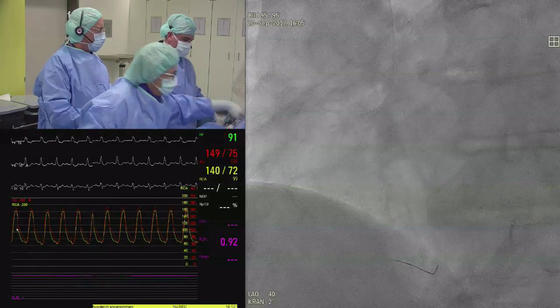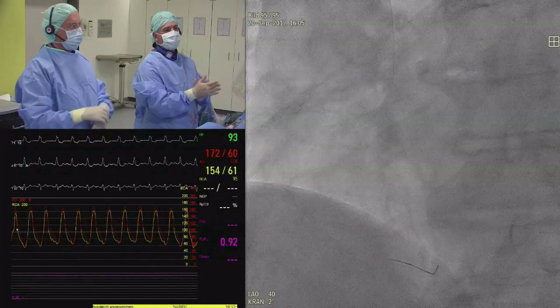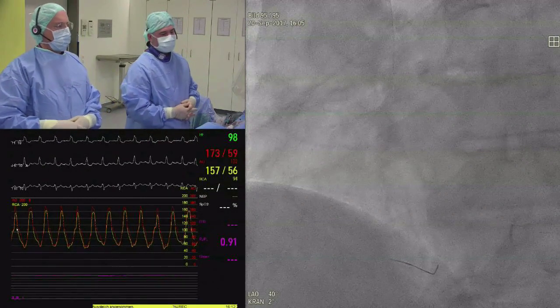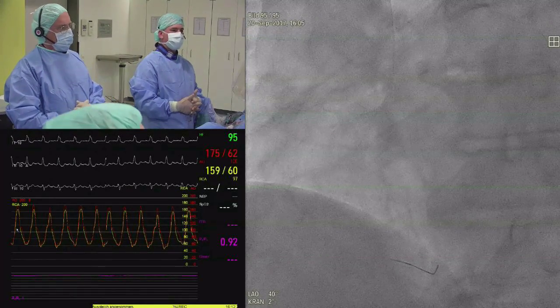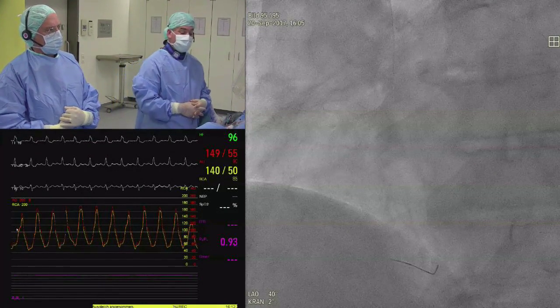So you're planning to give adenosine infusion, right? Yeah, that's our standard. It gives us the possibility to do a nice pullback. So that's how we do it here. Okay. Also, if you want to do a pullback, that's the only option. And in the right coronary artery, giving an IC bolus, a large bolus, sometimes ends up giving AV block, which is not the case with IV adenosine.